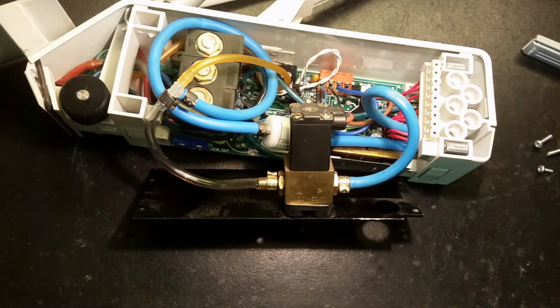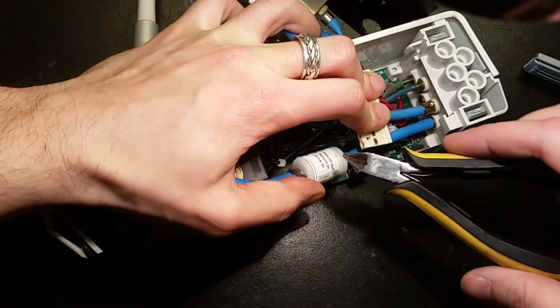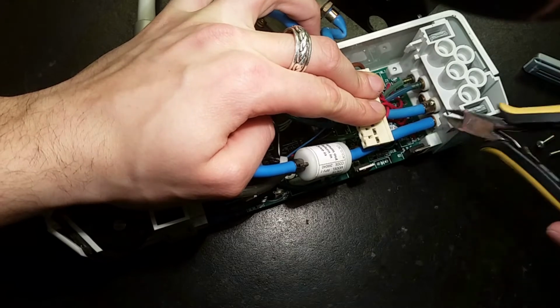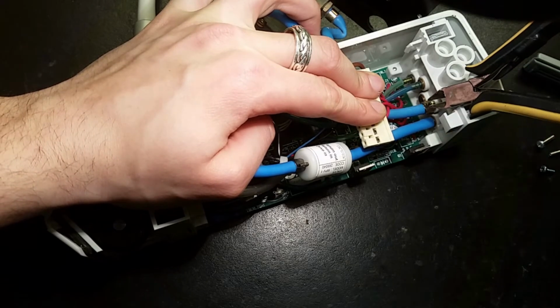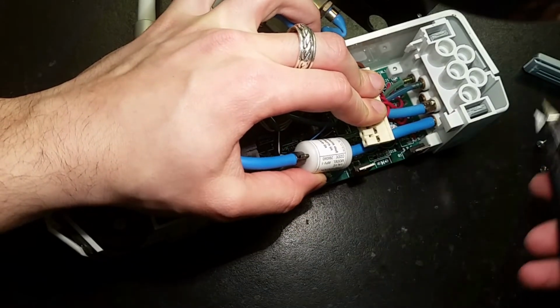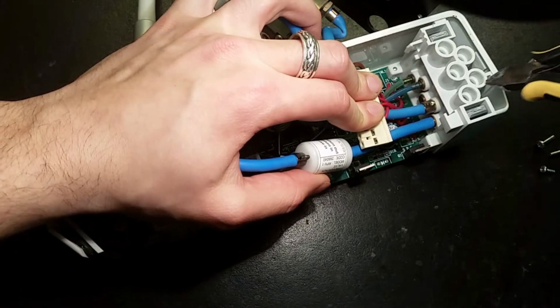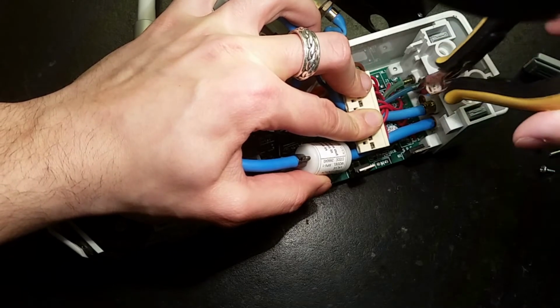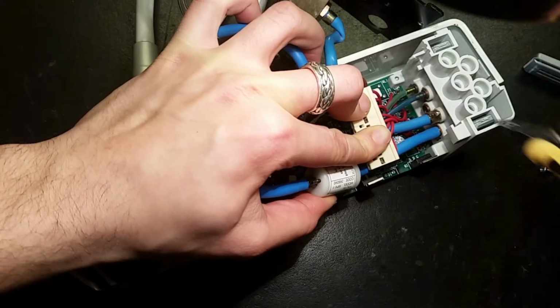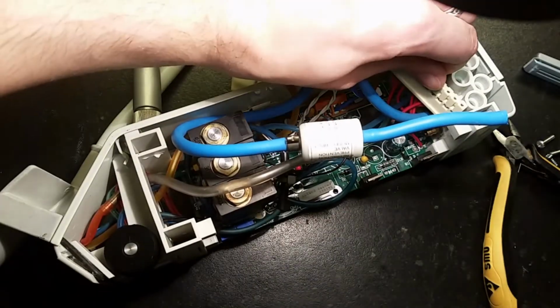Yes, this is this thing here. Oh shit! So before we go further in, I want you to see this here. This is the return out. It doesn't have any crimp here. This one has one of these crimping things on it to keep it tight and sealed. But the return doesn't have any. That's hopefully the return air. And here we're supposed to have some water or vacuum or something. Definitely one of these is water. Maybe this one in the middle is vacuum, because it's not even connected anywhere. It has this plug on it. So yes, you just pull out that, and this is the connector.